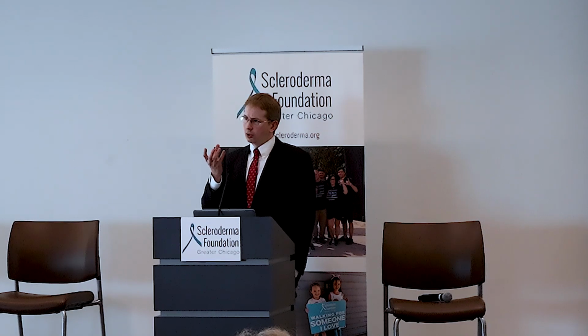And when we use ultrasound to make these measurements, it's actually very reliable from different examiner to different examiner or from exam to exam. It's far more reliable than our skin pinching Rodnan skin score. But essentially, that's kind of all we know.